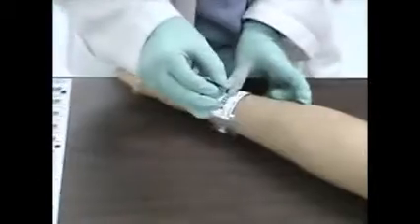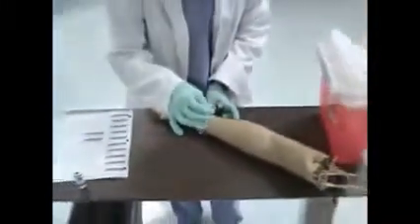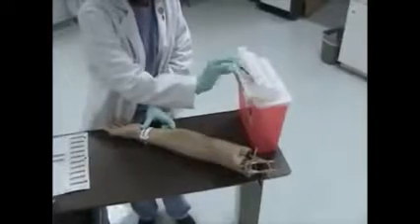I will withdraw the needle at this point, using my safety device on a tabletop. I will cover my sharps and immediately place them into my sharps container.